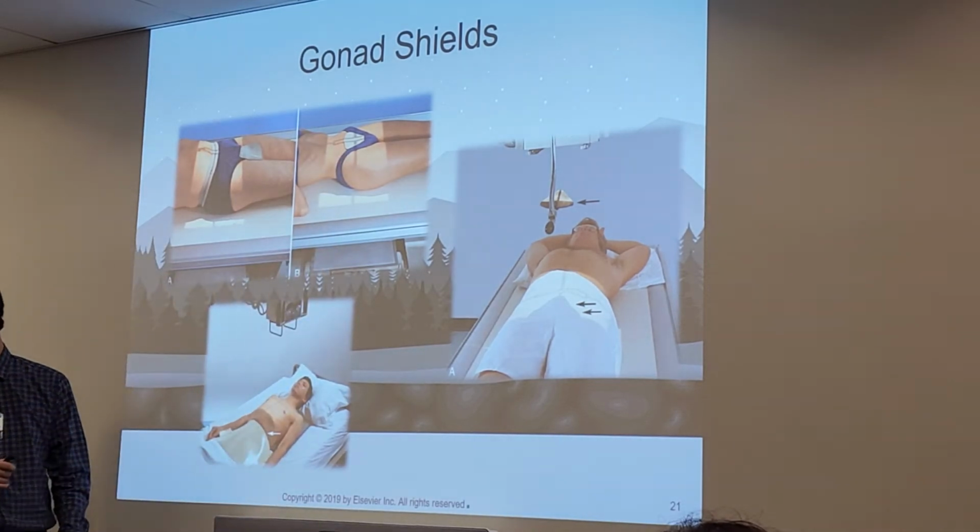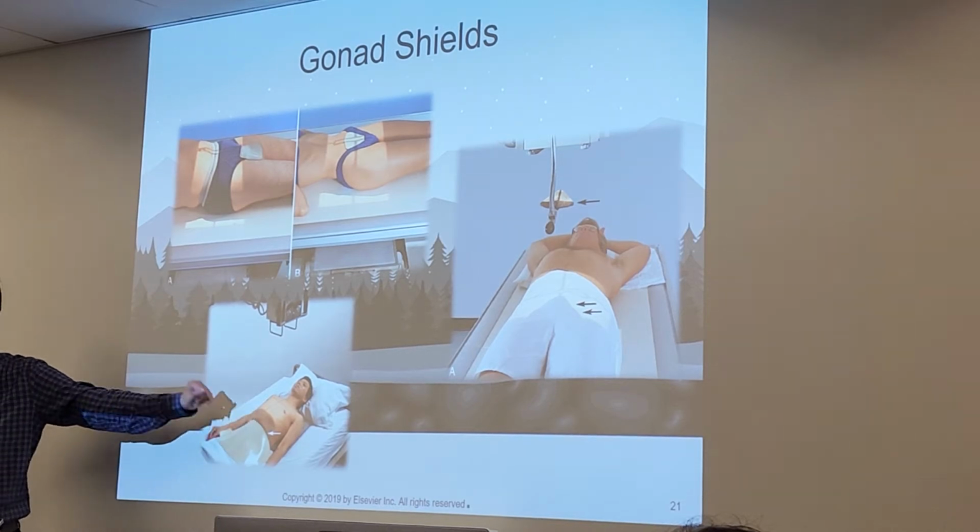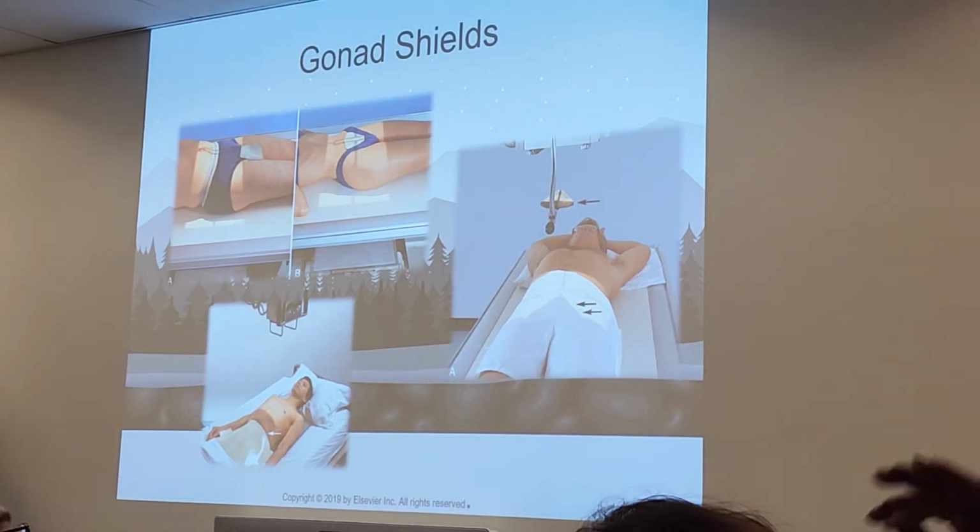Specific to the actual anatomic part. And then we also have the large gonad shield, right? The large aprons.